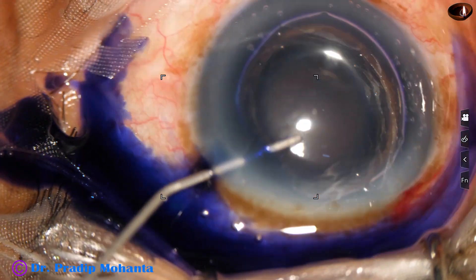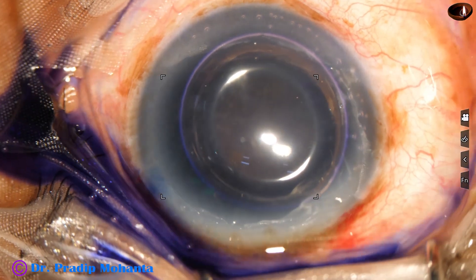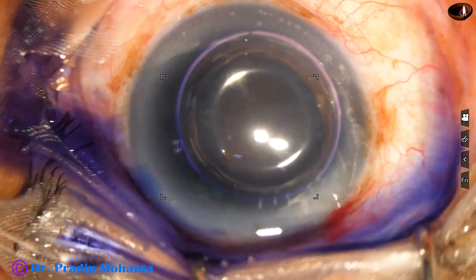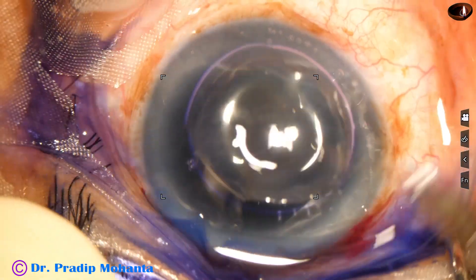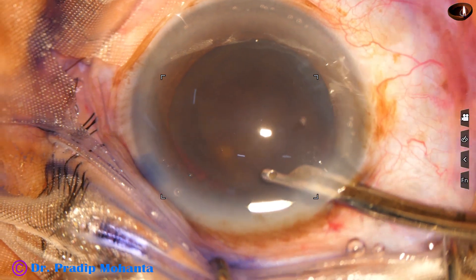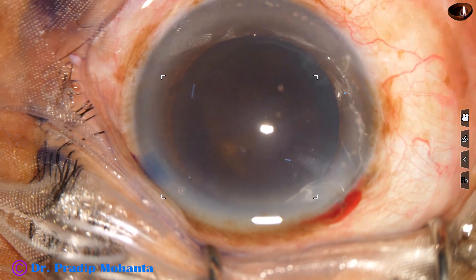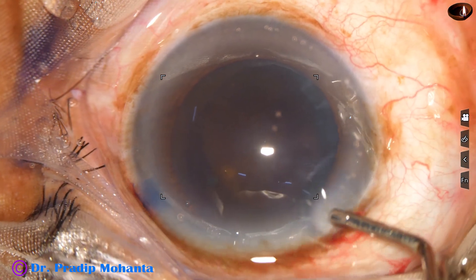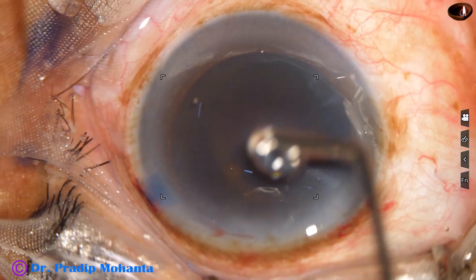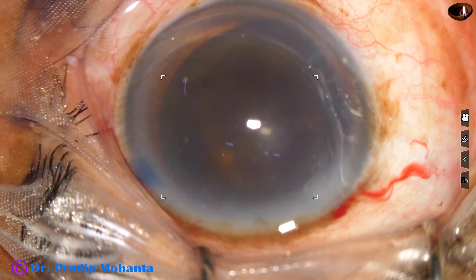Trypan blue dye is applied over the anterior capsule. When the dye is applied underneath an air bubble, staining is quick. This is a bit of adrenaline. The dye is then washed out with the help of a 23-gauge Simcoe cannula and BSS.